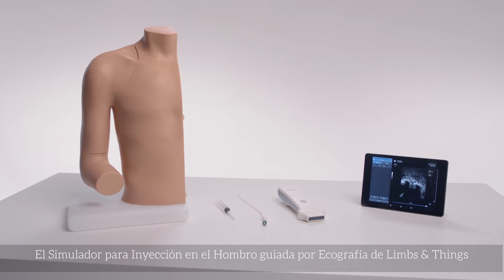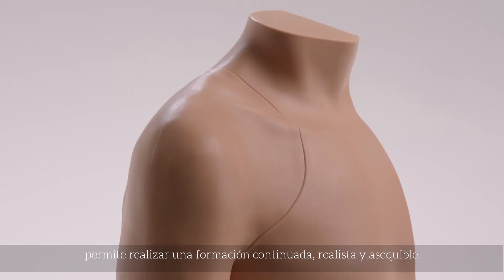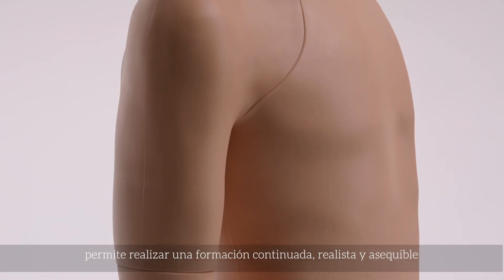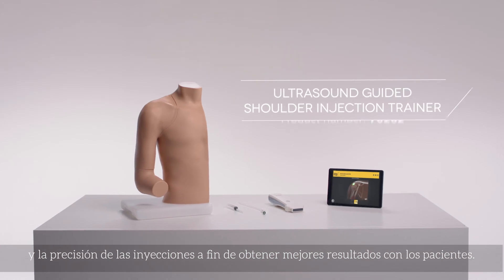The Limbs & Things ultrasound-guided shoulder injection trainer allows cost-effective, realistic, and repeatable training to improve trainee confidence, accuracy of injections, and patient outcomes.